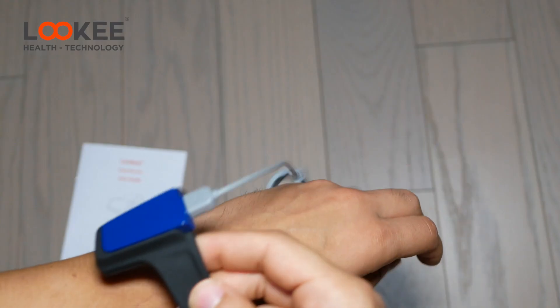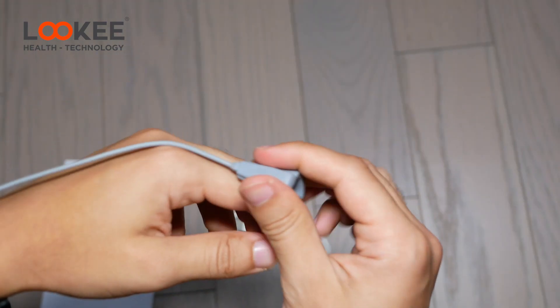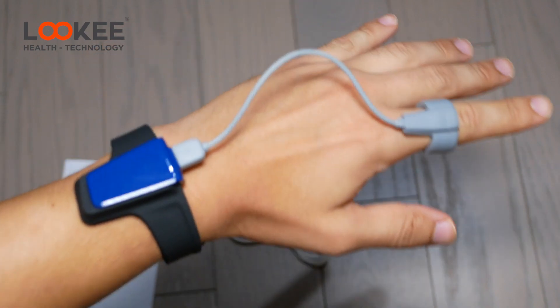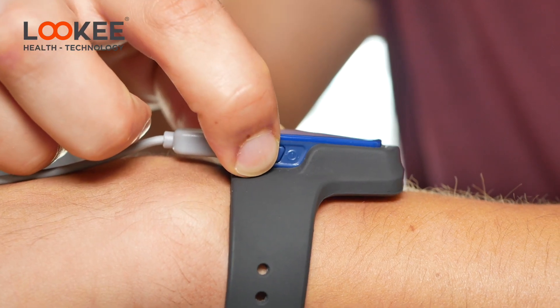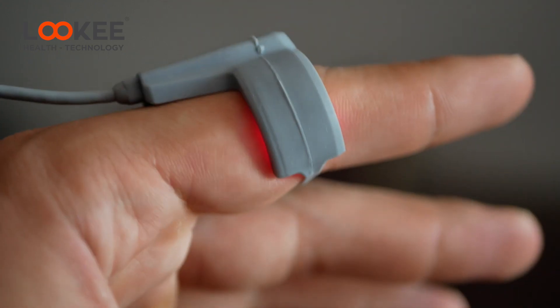Turning this on and starting your sleep tracking is super simple. All you have to do is put it on your wrist, then put the sensor on any finger — whatever is most comfortable. I personally use my pinky finger. You just turn it on, go to sleep, and that's it — you're tracking your sleep all throughout the night.